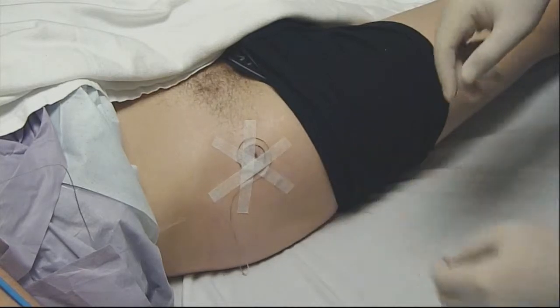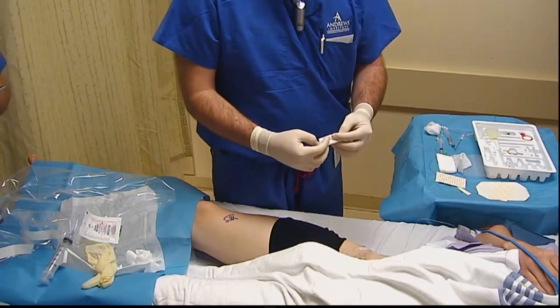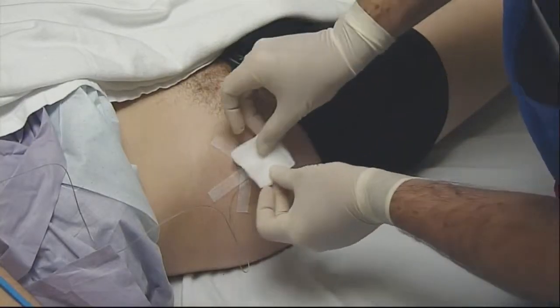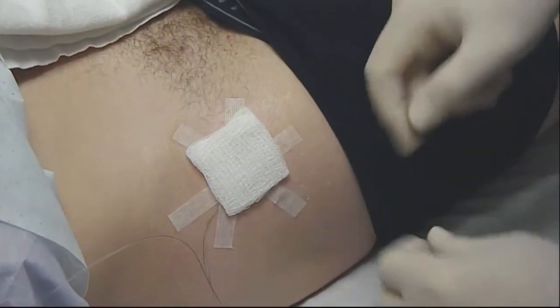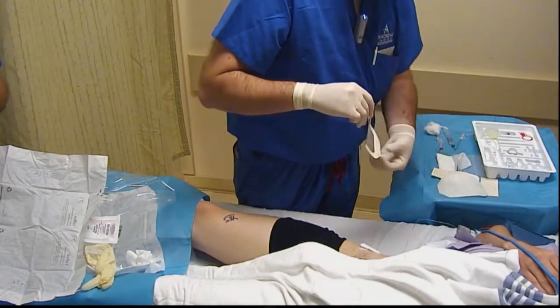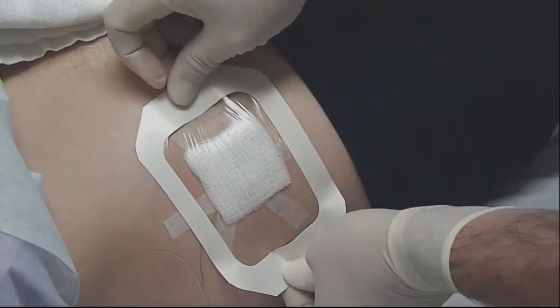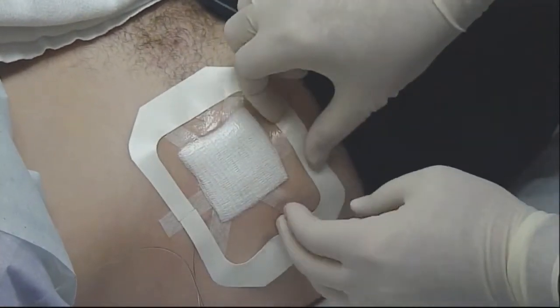This particular location — the lower extremity femoral block — tends to leak more than some of the other locations. So to help protect against leakage, I'm going to apply a sterile 2x2, as you can see here, and just lay that right over top of everything. Then the last step is to apply a sterile Tegaderm dressing on top of all of this. That 2x2 also helps to act as a little bit of a pressure dressing and again helps minimize the possibility of leakage.